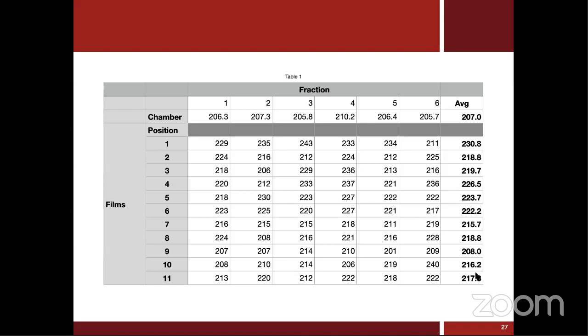Another example would be if you want to use the films to measure, for example, gonad doses, where you have them shielded. I think the signal is going to be low, but what is the dose? There is a large uncertainty in the dose that you're going to measure with films. So I wouldn't recommend using films to measure under shielding, for example, or at the skin for photon beams. But if it's like what we do on TBI, then I think that's not a problem.